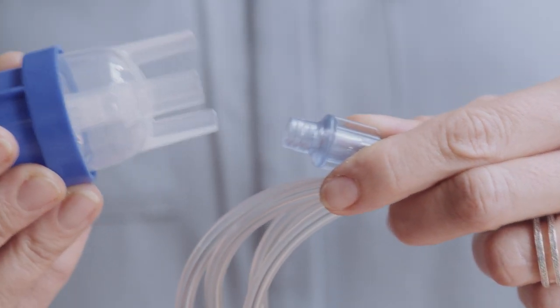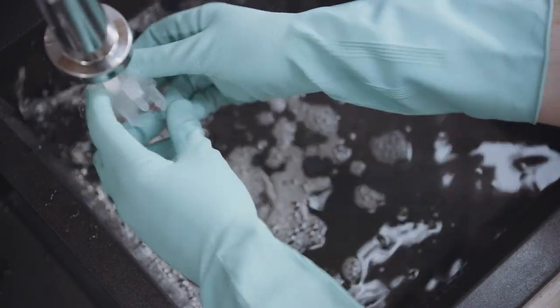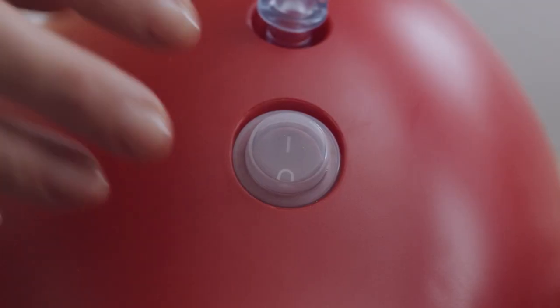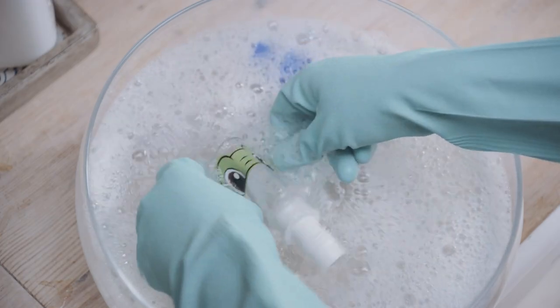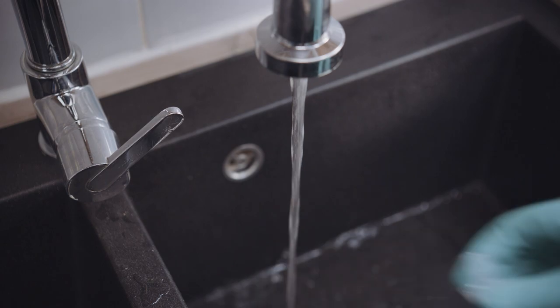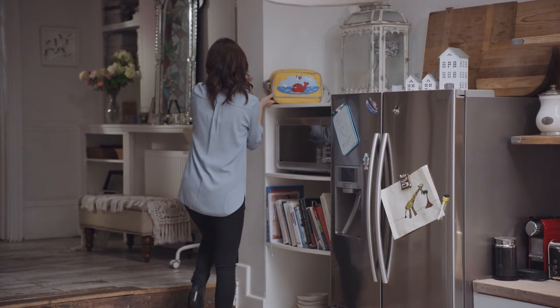Disconnect the Sidestream from the tubing. Unscrew the top from the medicine cup, rinse out the nebuliser and refill with clean water. Reassemble the top and medicine cup, reconnect the tubing and run the Sidestream again for a few seconds to flush out any drug trapped in the nebuliser jets. Disconnect the tubing from the medicine cup and wash all items, apart from the tubing, in hot soapy water. Rinse all parts in clean water for two minutes. Shake off excess water and allow to air dry — do not towel dry. Reassemble and store the Sidestream in a clean place when not in use.